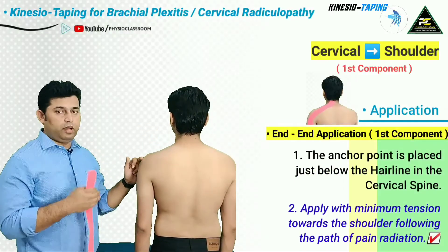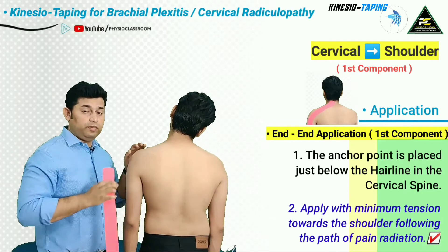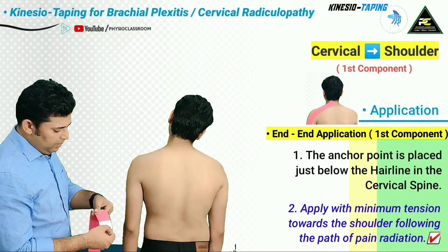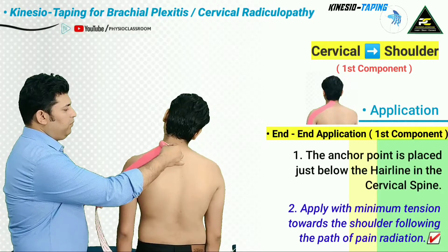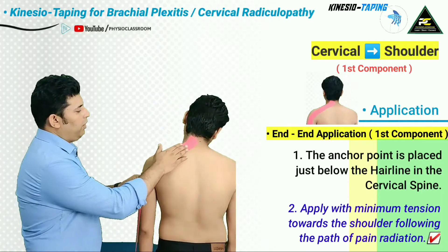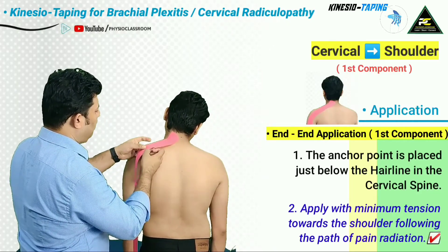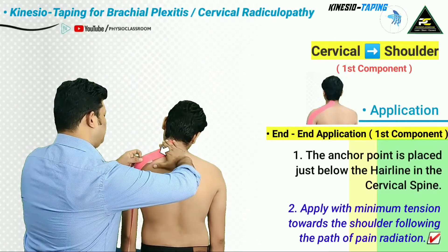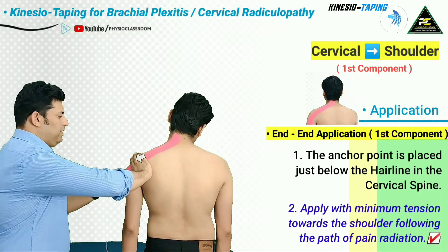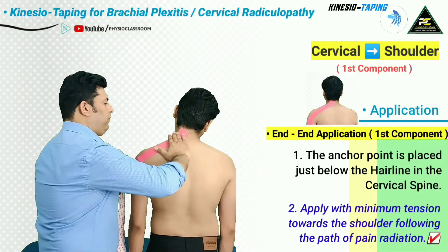The first component is placed under stretch by asking the patient to side flex toward the contralateral side within a comfortable limit. The therapist creates an anchor by tearing the paper backing and applies it over the most proximal point just at the base of the occiput. After applying the anchor, it is rubbed, the paper backing is removed, and with only minimal stretch, the therapist follows the course of the patient's pain radiation up to the shoulder joint, finishing the first component.